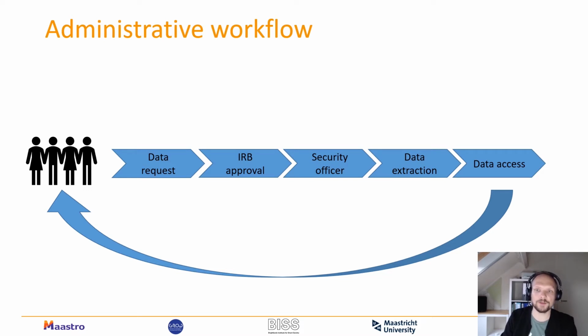And after this data extraction has happened, that folder or that partition on the clinical PACS system will be made available to the researcher, or the researcher will get authorizations to access that, and he or she can work with the actual data for that specific research project.